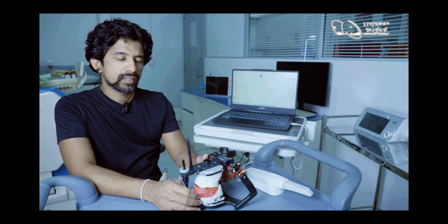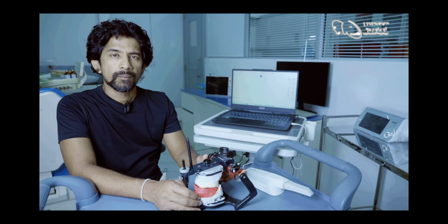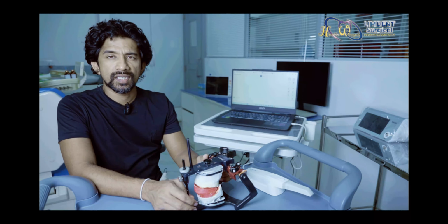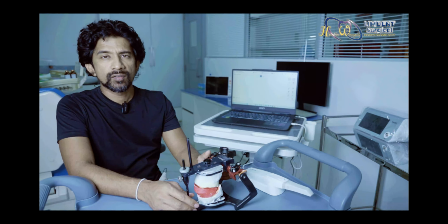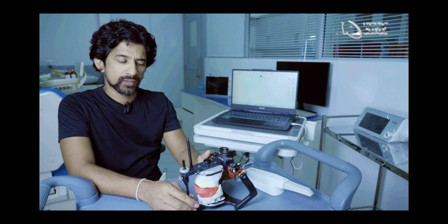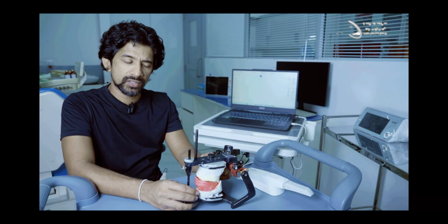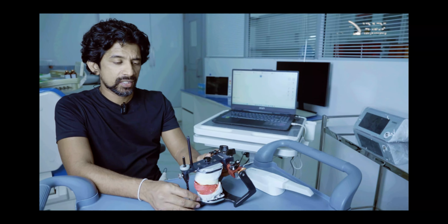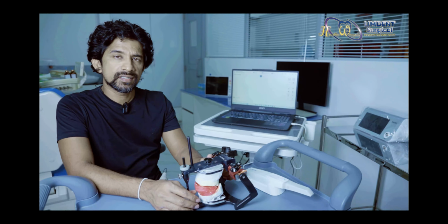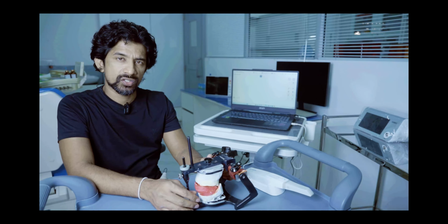Once you have made that, there are several ways of getting the bite registrations of the patients. But in this case, the completely edentulous case with All-on-X implant placement, you have to go for the full mouth bite registration. Once you get the final impressions and bite registrations, the cast will be mounted in an articulator, so we can get this data to the computer to proceed with the virtual bite transition.